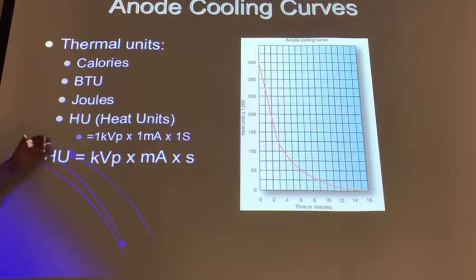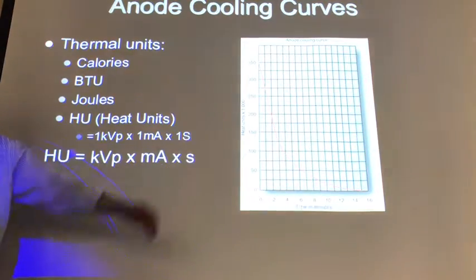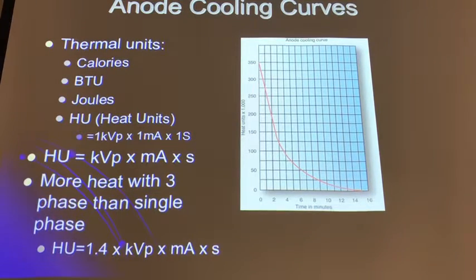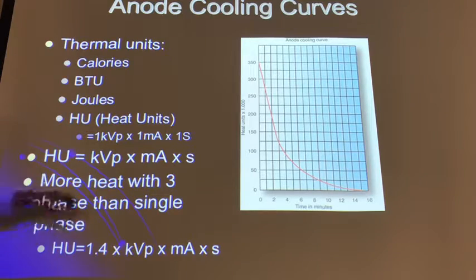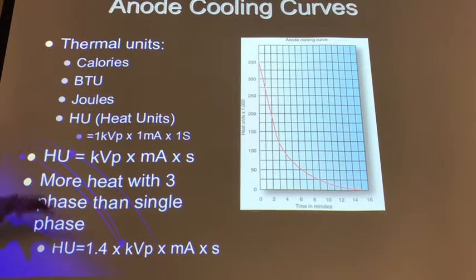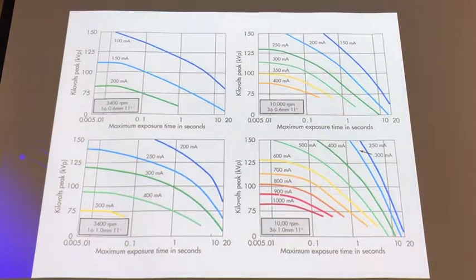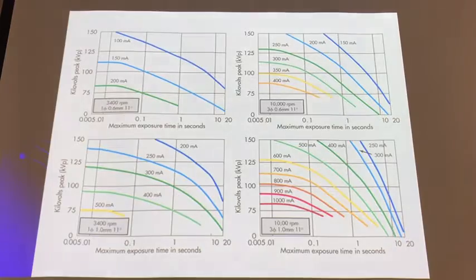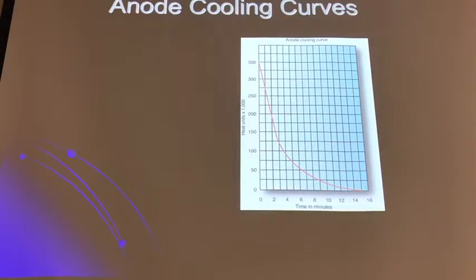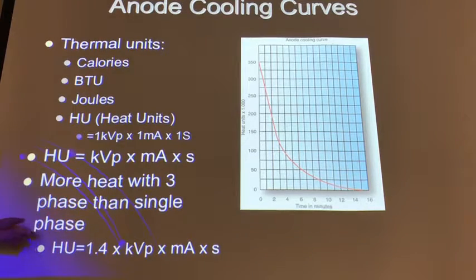And the hotter an X-ray tube gets, the longer it needs to cool off, okay? So more heat, this is important. More heat will be created with three-phase than single-phase units. If you go back to the charts that I did on the previous slide, that's what you see here. With any of these high mA stations, you create more heat, okay? And you will need more time for dissipation, okay? So, more heat with three-phase than single-phase units.